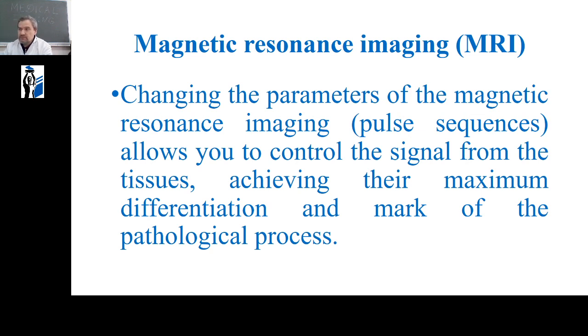Earlier, we noted that depending on the mode of operation of the magnetic resonance imaging machine, images of various organs and tissue look different. The mechanism that controls the tomograph and causes the tissues to separate from each other by relaxation time is called pulse sequences.